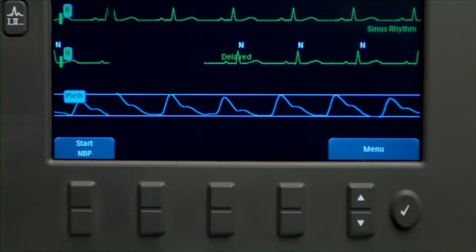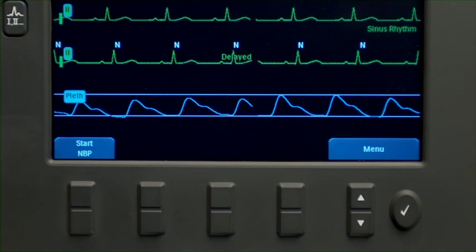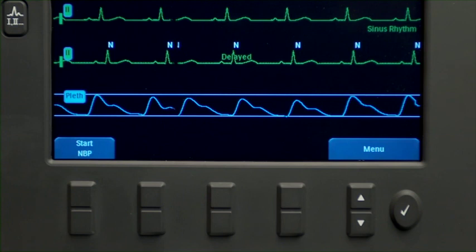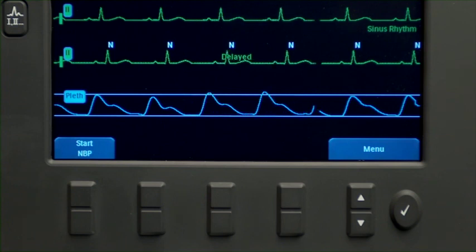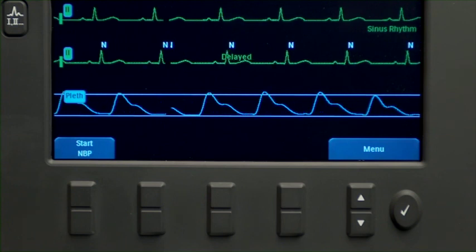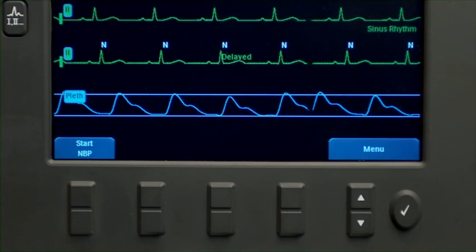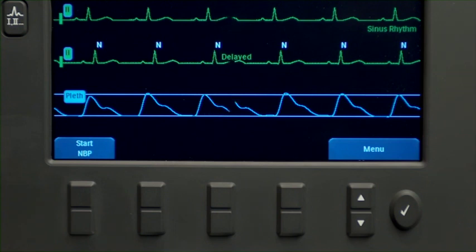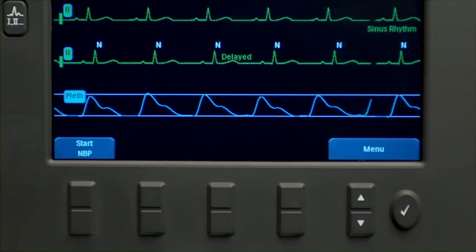The XL Plus uses the STAR basic arrhythmia algorithm for monitoring arrhythmia. It monitors infant, child, and adult patients' ECGs for heart rate and ventricular arrhythmias and generates alarms. It only uses the ECG lead appearing in Wave Sector 1 for single lead arrhythmia analysis.